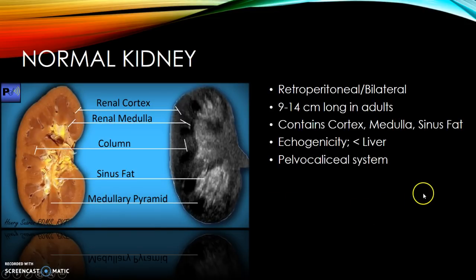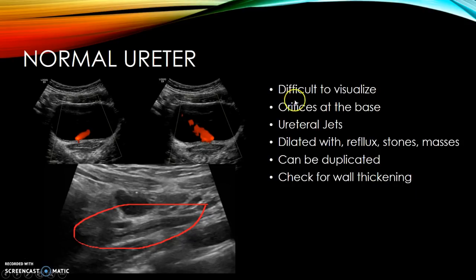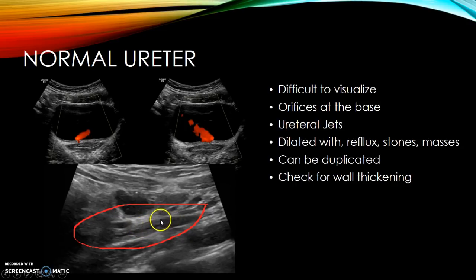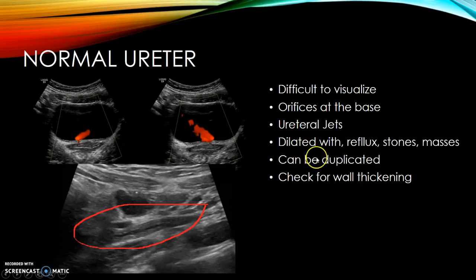Normal ureters are usually difficult to visualize unless you use a high-resolution transducer, and even then they can be hard to see if they're not dilated. When dilated, they become visible — here's one with wall thickening in a patient with an infection. You can use Doppler to see ureteral jets, which is urine entering the bladder in real time. Ureters are usually dilated due to reflux, stones, or masses, and can be duplicated. Check for wall thickening when scanning.